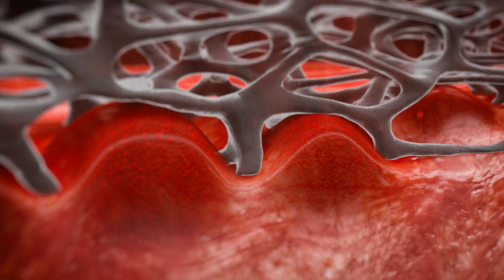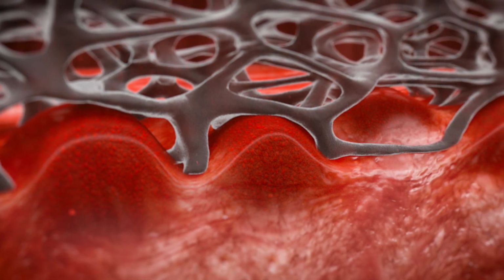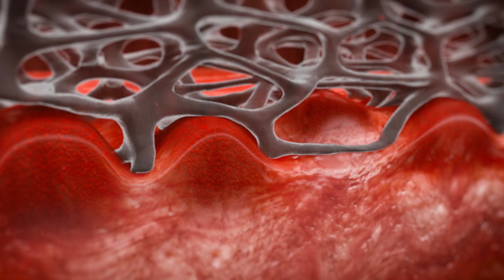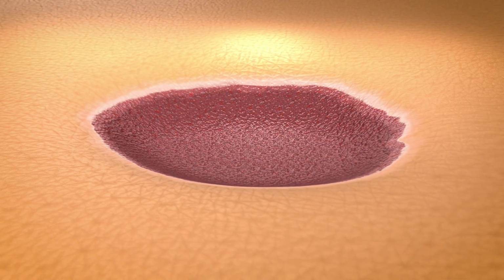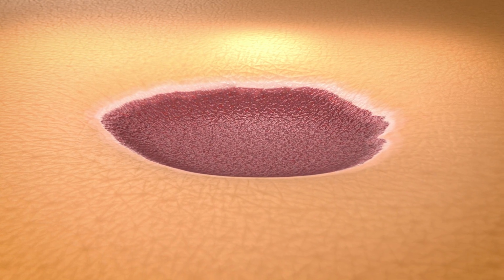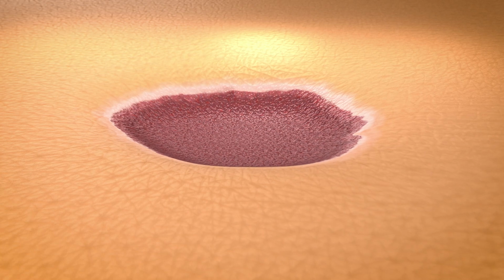All of this activity leads to the formation of healthy granulation tissue in the wound bed, and the characteristic undulations that have been seen in wounds managed with 3M VAC Therapy. Over subsequent dressing changes, the granulation tissue fills the wound bed, further reducing the wound volume and preparing it for final closure by secondary or delayed primary intention.